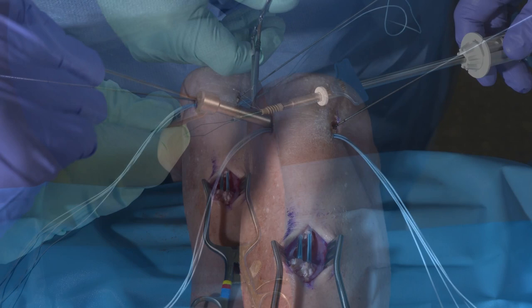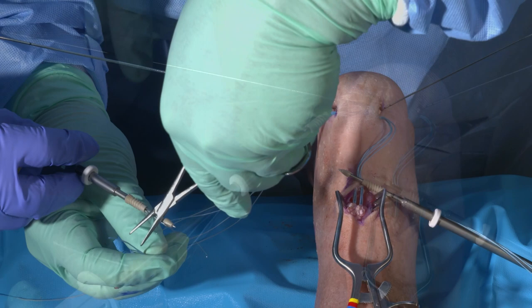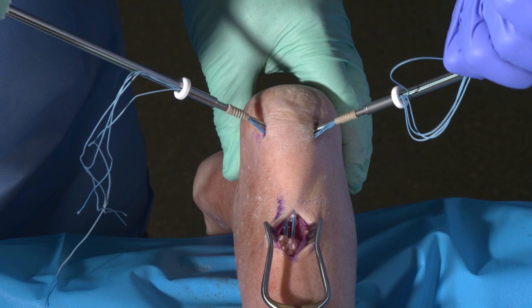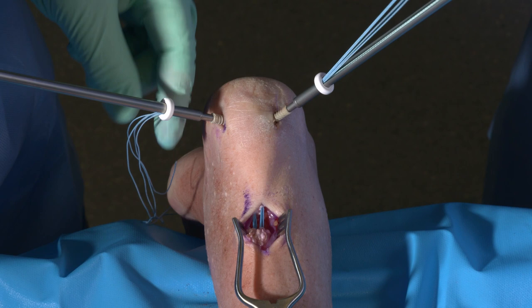At this stage, the limbs of suture are inserted into the anchor system with the strands pulled approximately through the anchor. The same step is performed on the other strands of suture. The anchors are then inserted into the pilot holes. We can remove the temporary wires and insert the stems into the pilot holes. They can be pushed flush with the bone, and in certain instances one has to use a mallet to place the anchor to the level of the surface of the bone. It's important that both bone anchors are stabilized, and you may need to utilize an assistant for this portion of the operation.